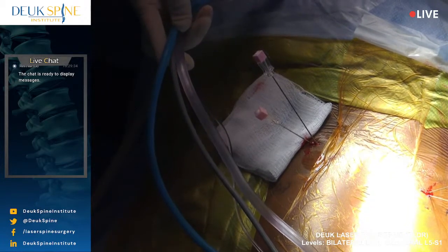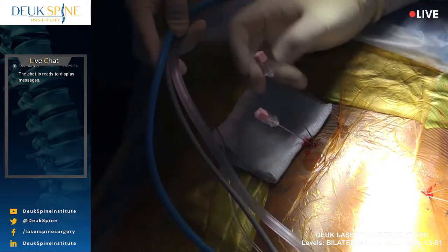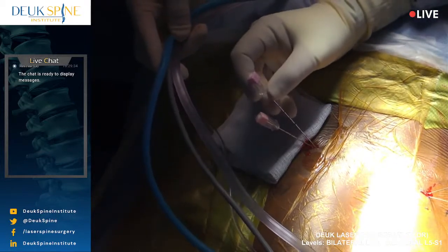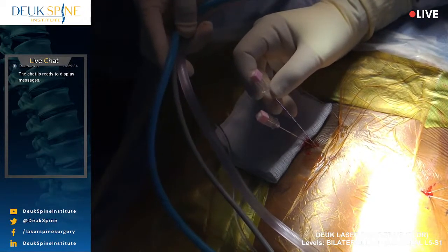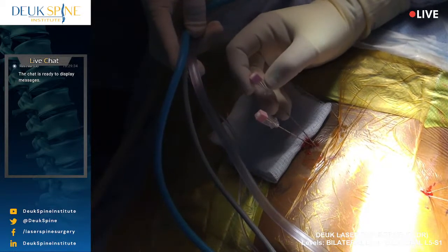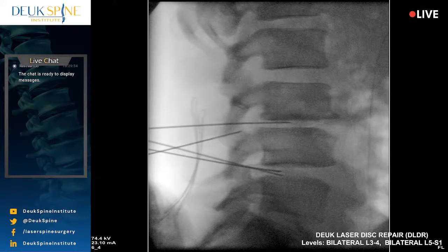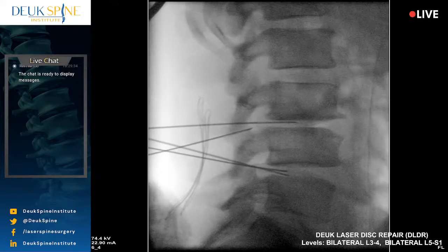I mean, could we be off that much? Can't possibly be. Huh? What? No, I'm just amazed at the trajectory that it appears to be taking. I can feel the herniation. I'm bouncing off of it. AP?